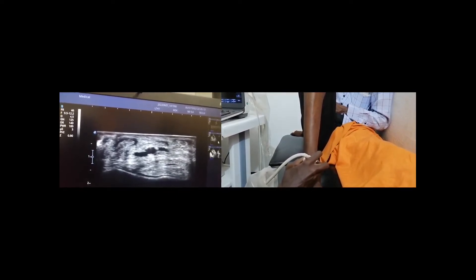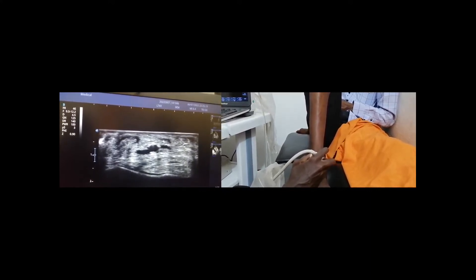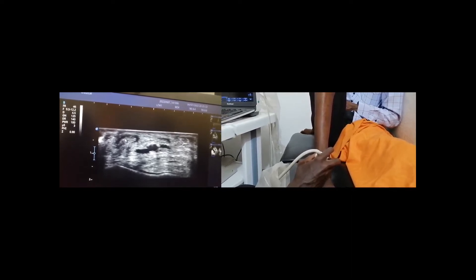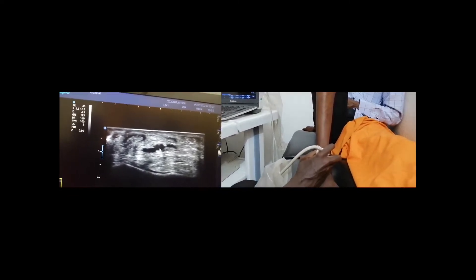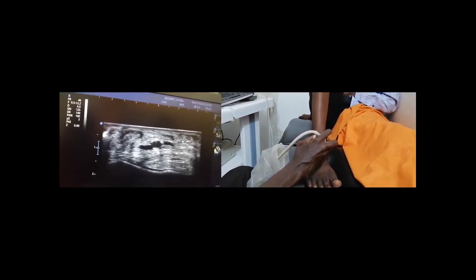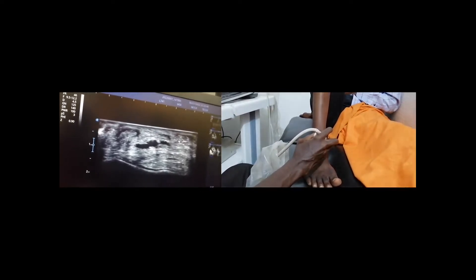So here we have the tibialis anterior tendon, we have the extensor hallucis longus tendon, we have the extensor digitorum longus tendon, and there is the neurovascular bundle. It is important to view every tendon in its full length in order to evaluate it completely.